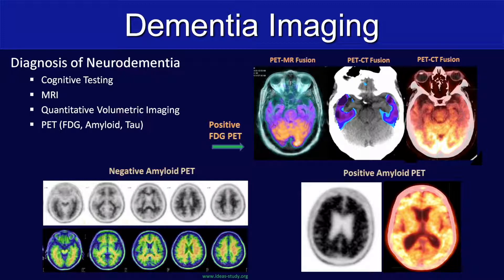This is an example of a positive FDG PET. The PET-MR fusion is on the left, the PET-CT fusion is in the middle and on the right. Down in the lower right-hand corner, we have a positive amyloid PET — you see diffuse binding of the tracer to the cortex throughout. On the left side here is a negative amyloid PET for reference, and you see the cortex looks light with no binding there.